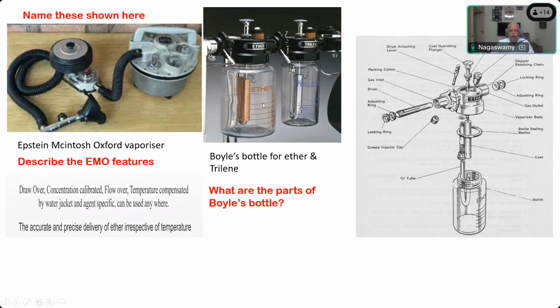Okay. So after about half an hour or 45 minutes of use of ether in a second or third position, you will see the bottle will be covered with water droplets. So in those days, jokingly, we used to say, ether bottle is sweating to anesthetize your patient, because it forms the water droplets condensed from the air surrounding that. So once the bottle gets cooled, the coolness is transferred to the bottle. Will it increase the vapor or will it decrease the vapor formation? It decreases the output, sir. Decreases the output.